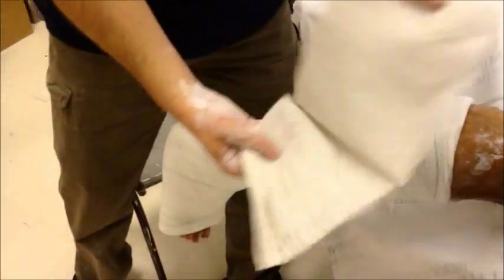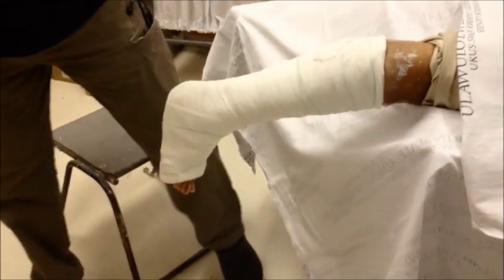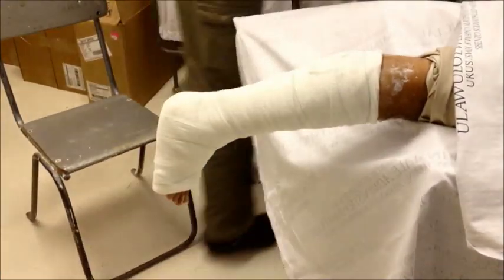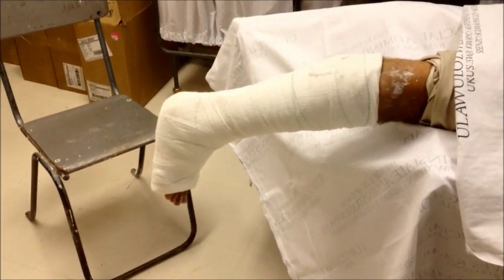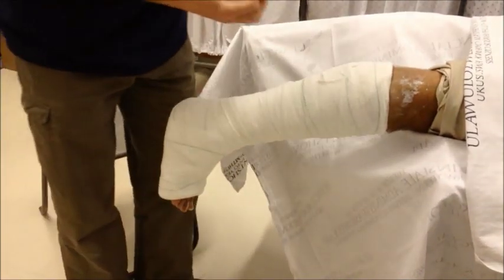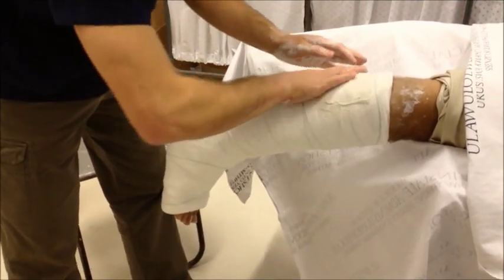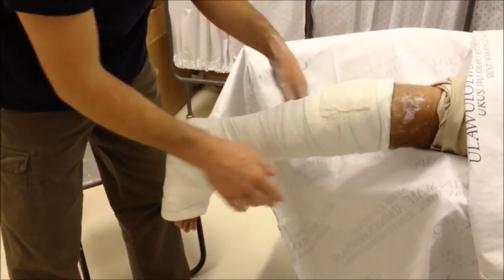There are many ways to fix your plaster. You have some leftover plaster from what you used, so don't waste money on elastic bandage or something else. I'm just going to make a little plaster repair strip — dip it, get the excess water off, lay it, and laminate it in.